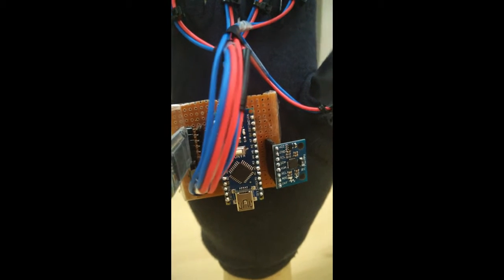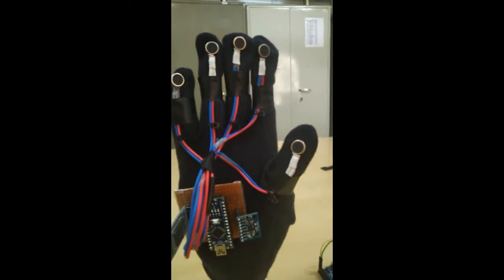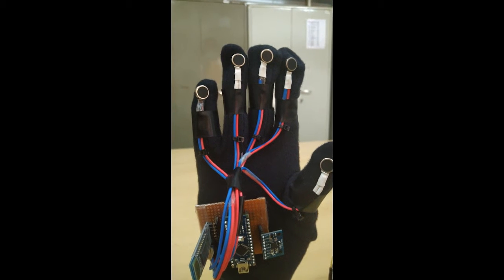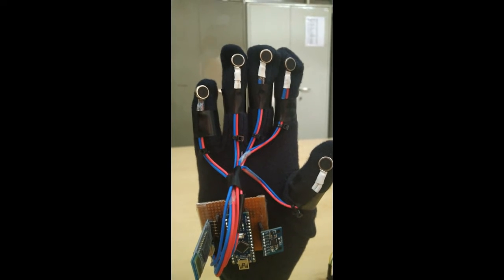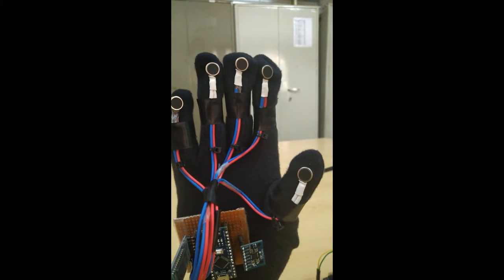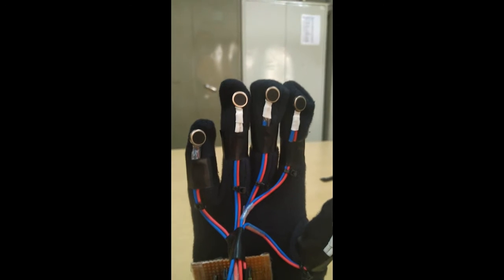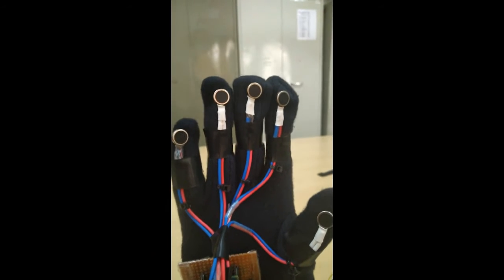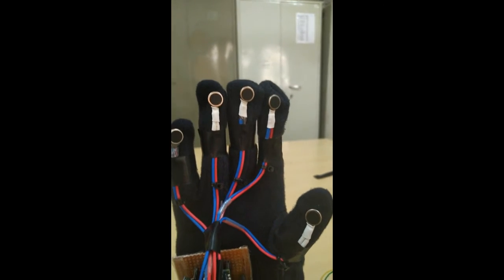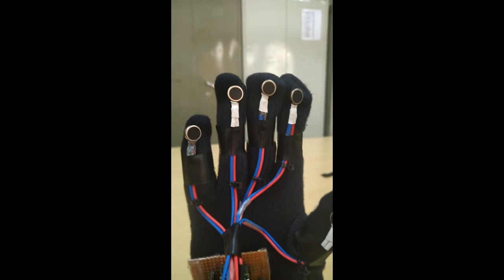Now see that these coin motors will generate vibration based on your hand tremor. If your hand tremor is high, accordingly the vibration will be generated with these coin motors. If it is low, the vibration would be generated for that level of hand tremor.